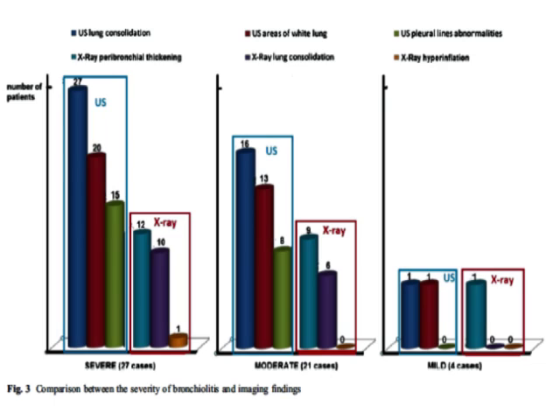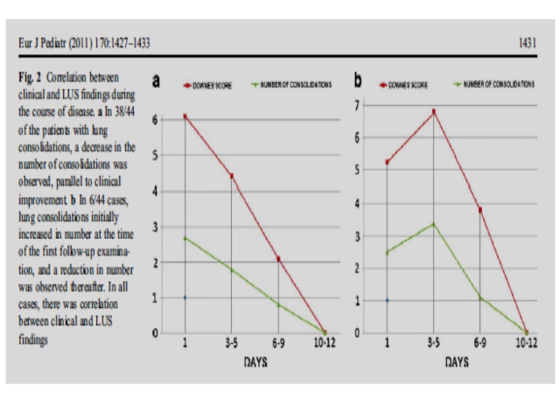What we want is a better way to stratify the moderate from the severe kids, to see who we have to admit and who we can send home. Now, these are just a few studies. This isn't huge numbers, but I think there's a lot of potential here because we don't really have a good way to look at these kids in a quick and efficient manner and test them.